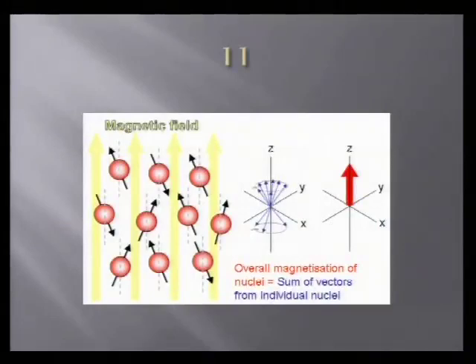As we sit here on Earth, they're all over the place and completely random. However, in a magnetic field such as a 1.5 or 3 Tesla magnet, a humongous magnetic field, all the hydrogen protons align parallel or anti-parallel, so you get a net magnetic moment that, without any RF pulse, is in the parallel direction.